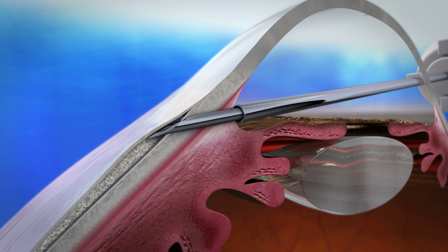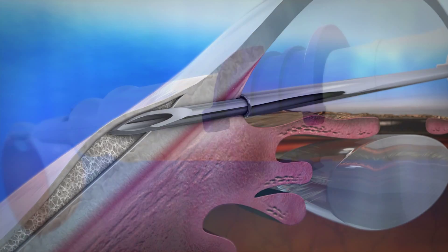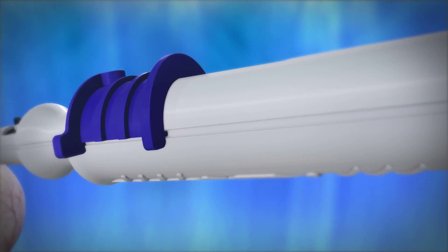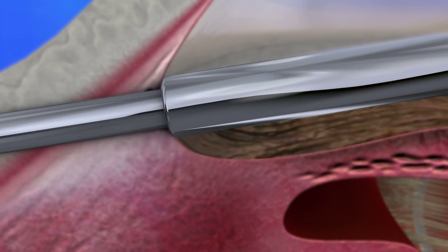The needle is then rotated towards 12 o'clock. This rotation helps avoid the soft stent from curling. The gel stent is delivered by actuating the slider on the one-handed injector, while the other hand maintains gentle fixation on the eye. The sleeve provides longitudinal placement control during the deployment.